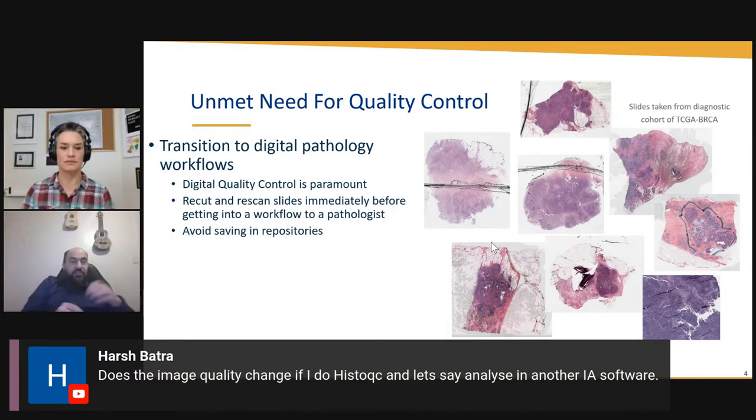Right? You know, if the scanning was instantaneous and the slide immediately somehow disappeared out of the scanner, this wouldn't work. But it takes time to scan each of those slides. As a consequence, there's a really nice opportunity to stick a bunch of quality control algorithms in parallel. By the way, slide number 57 was blurry. Even though I know you're scanning slide 150, I just finished processing slide number 60 and there's a cracked cover slip or something. You might want to check that, right? So there's kind of an opportunity there.